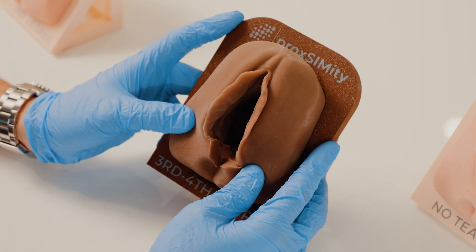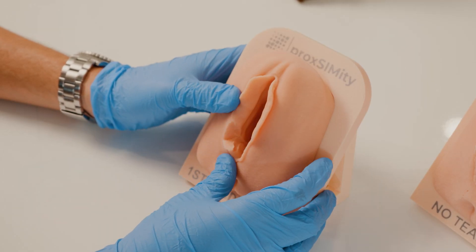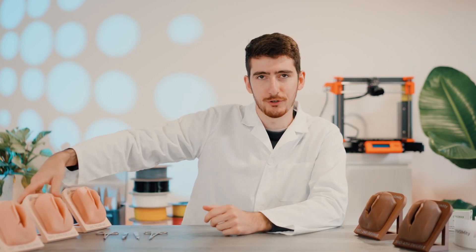My name is Artur, and we are at Proximity. Today I want to show you our episiotomy models. They come in different skin tones and they have three different levels of tearing, starting from no tearing to second degree and to third and fourth degree.